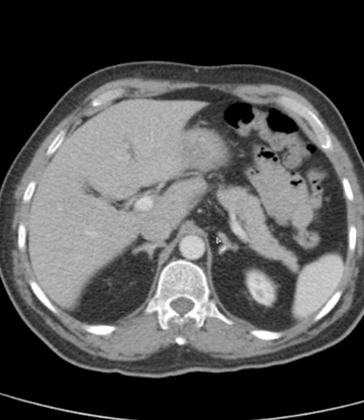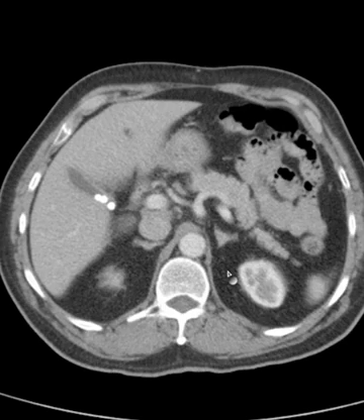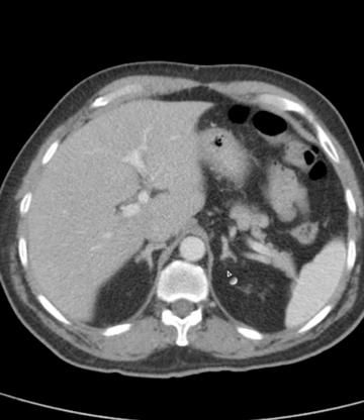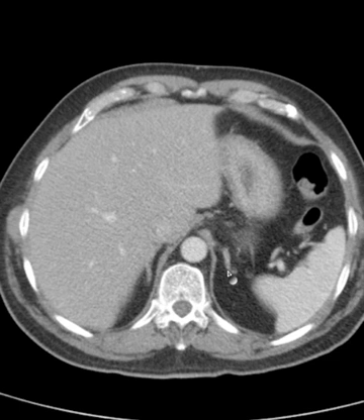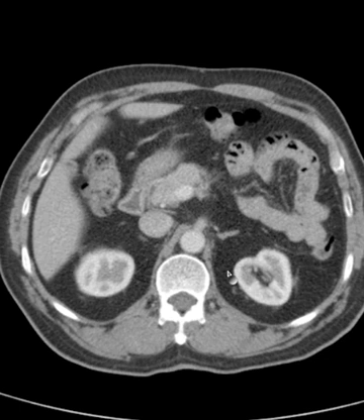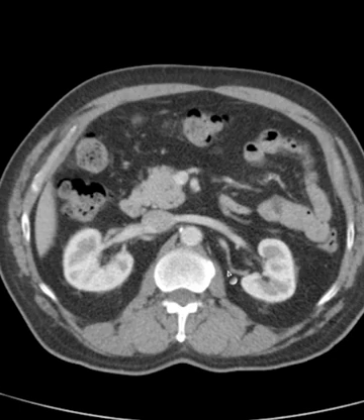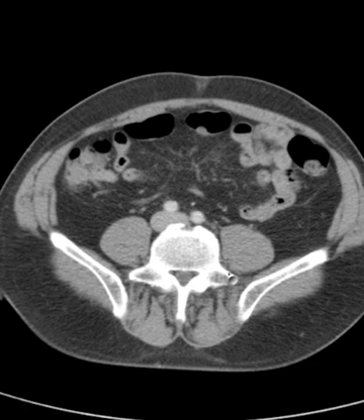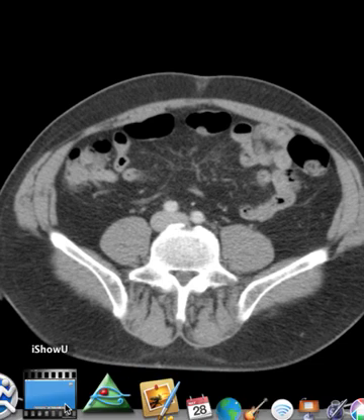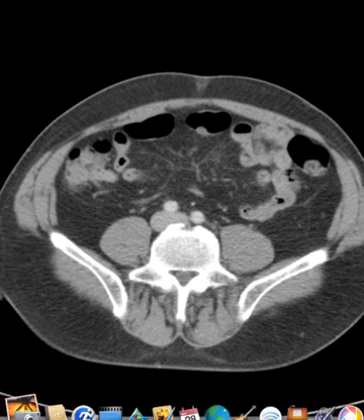Never forget our little friends, the adrenal glands. Here they are — a little pudgy, a little thick, but that's normal. That looks within normal limits, as we say. Great case of a renal cyst. Let's go. Thank you.